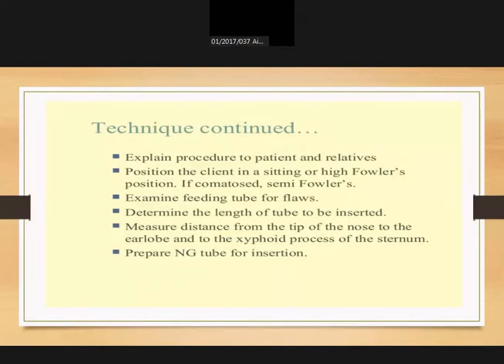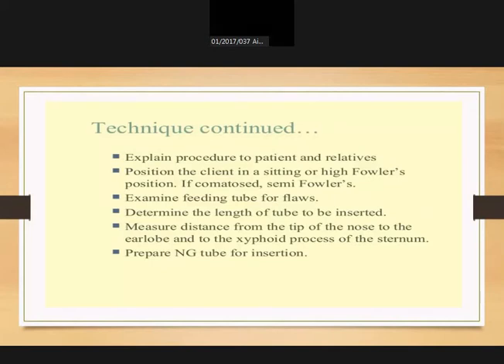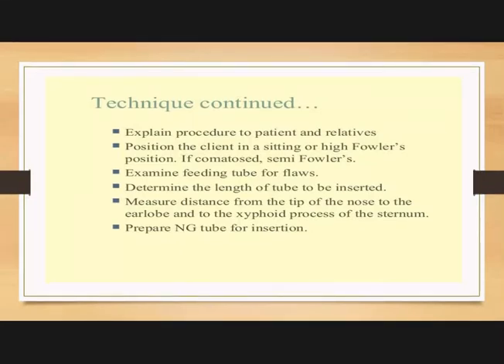Measure the distance from the tip of the nose to the earlobe, and then to the xiphoid process of the sternum. This is how to measure. Prepare the NG tube for insertion.